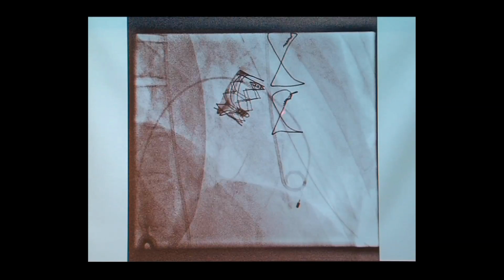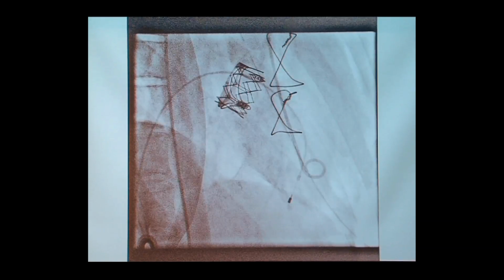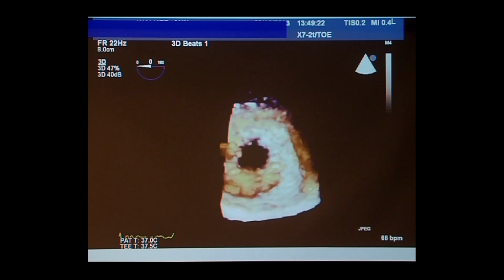And as you can see, the heart is not a very forgiving organ. See the amount of thrust it's giving to that. So you've got to really get this right. This is not to be performed in smaller institutions by less experienced operators simply because these are all very high-risk procedures. In the right hands, these yield very good results, but in the wrong hands, these can also go terribly wrong. So essentially, it is a question of the team, the surgical backup, the operator skill, a number of things, but the technology is now there that we can treat a lot of patients without open heart surgery to achieve these things.